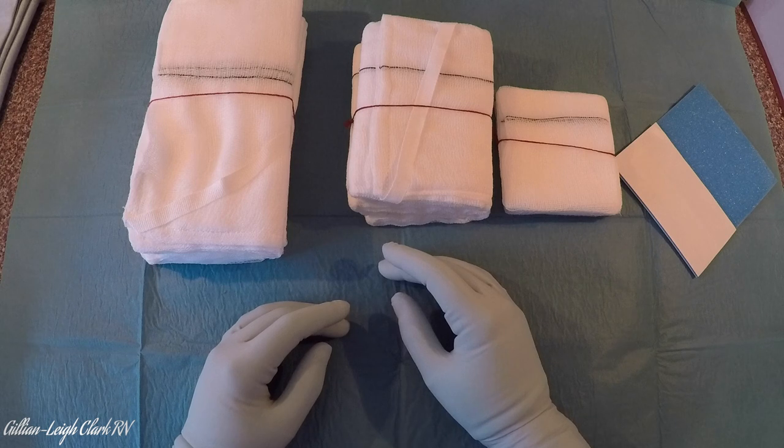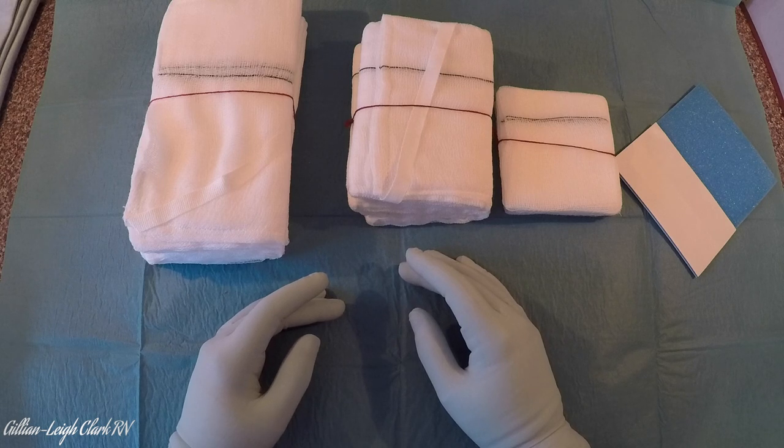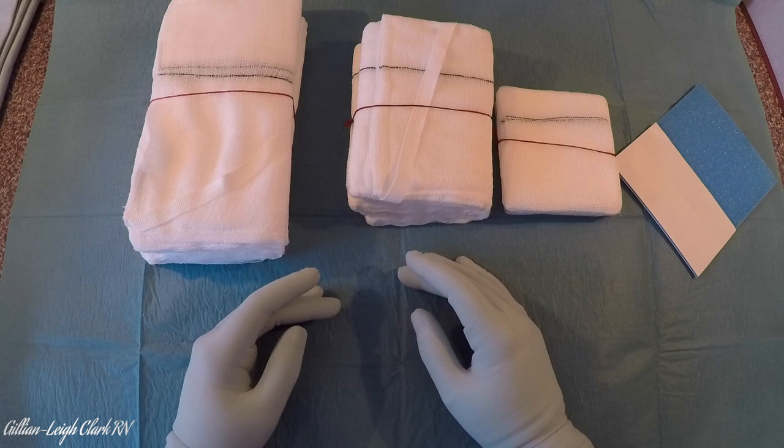When we're counting the swab, what are we wanting to know? We want to know that we have the correct amount of swabs, that they are the right size, that they're all the same size, that they're intact, that they have a Raytex strip, and that you've accounted for your red tag — because it is not x-ray detectable and must be accounted for and checked off in line with local policy.